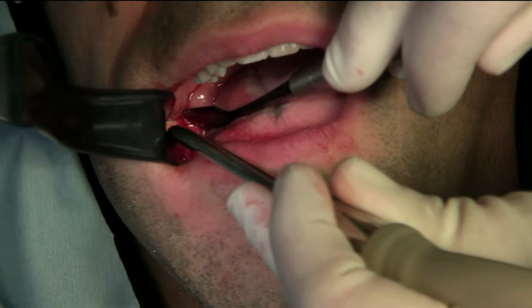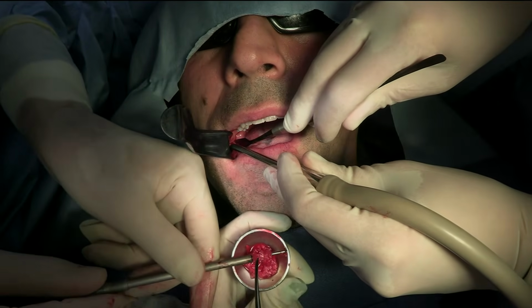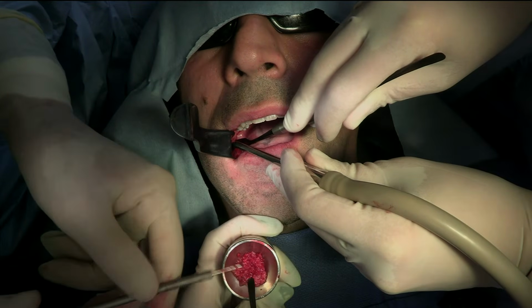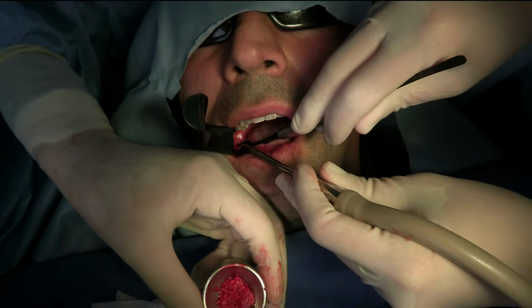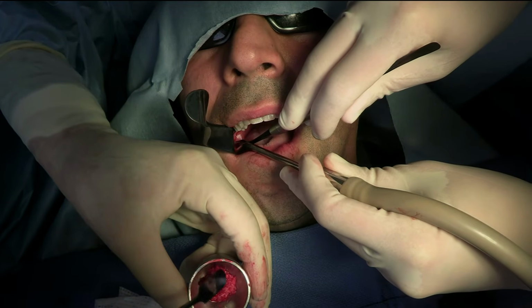Okay, one more. I'll check here now if that's enough. Let's see. That looks pretty good, solid.